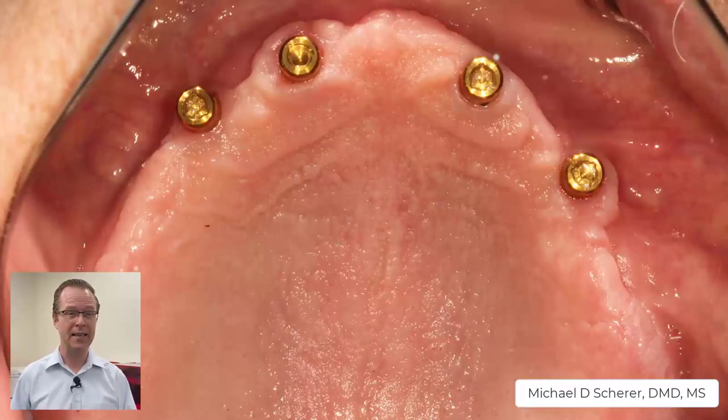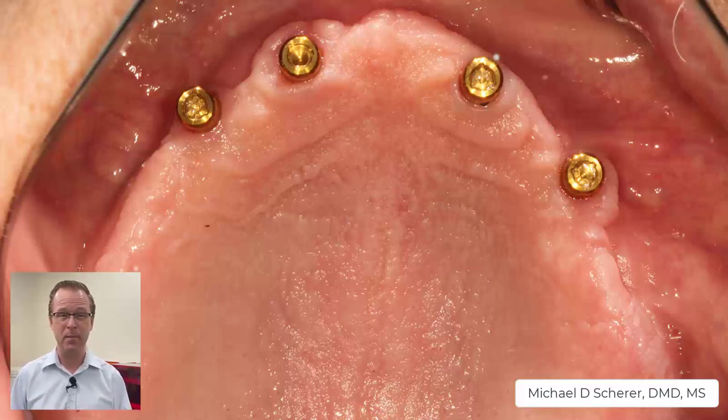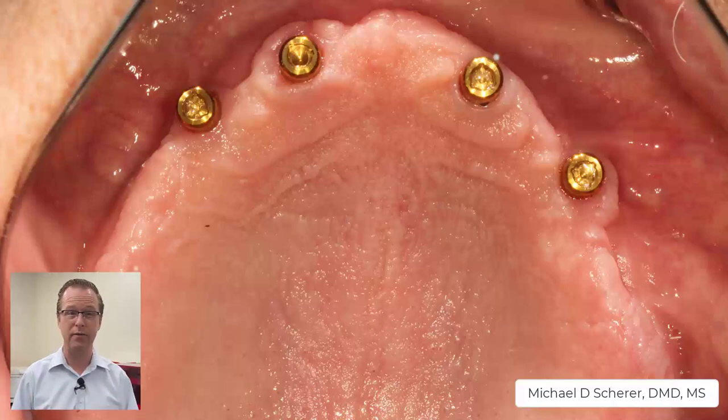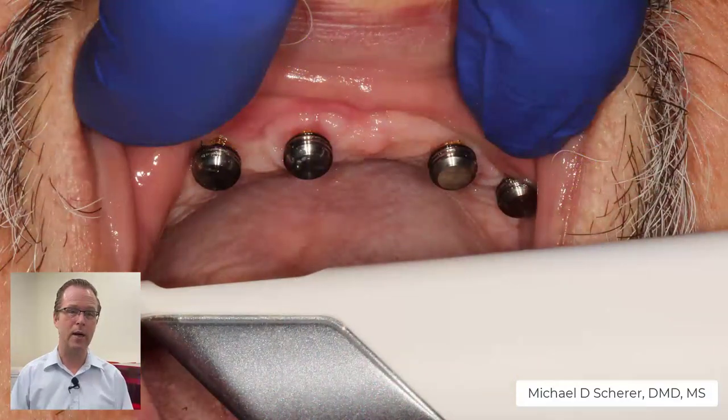I have a patient with a maxillary implant case with implants approximately in the 6, 7, 10, and 11 region. We placed standard legacy locator abutments on top of the implants and torqued the abutments down after confirming complete adaptation with a radiograph. Rather than just jumping right into the intraoral scan, if you scan the edentulous ridge with just the locators, you're kind of guessing at the actual position of where the housing is going to be on the laboratory side of things. What I like to do is utilize the actual housings that go on top of the locator abutment, place those on the locator abutment, and then simply scan with my intraoral scanner.